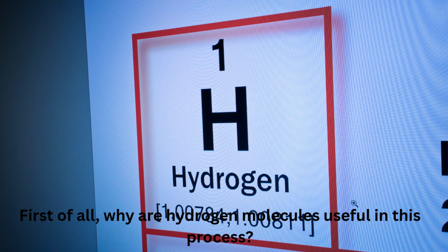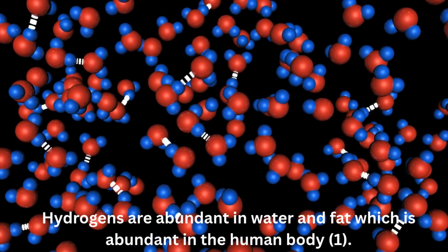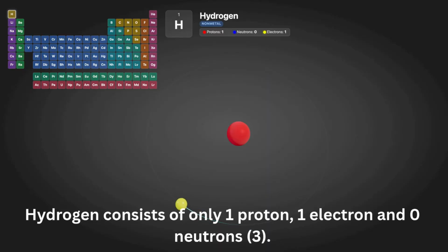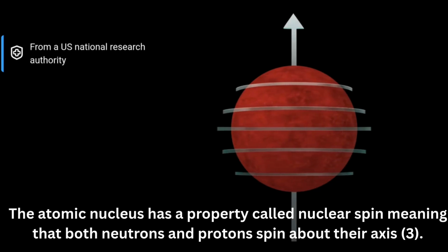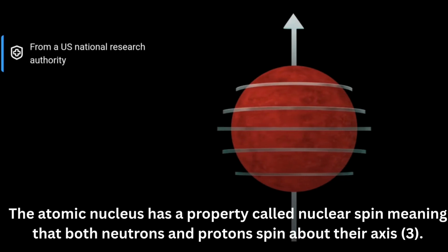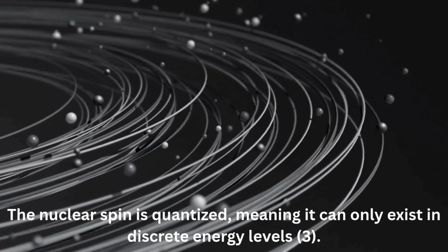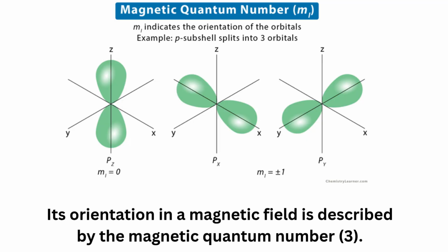First of all, why are hydrogen molecules useful in this process? Hydrogens are abundant in water and fat, which is abundant in the human body. Hydrogen consists of only one proton, one electron and 0 neutrons. The atomic nucleus has a property called nuclear spin, meaning that both neutrons and protons spin about their axis. The nuclear spin is quantized, meaning it can only exist in discrete energy levels. Its orientation in a magnetic field is described by the magnetic quantum number.